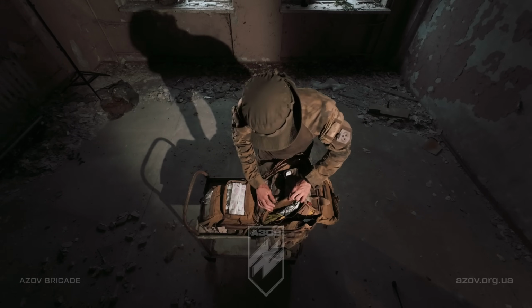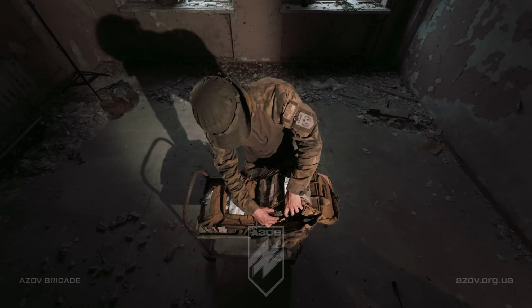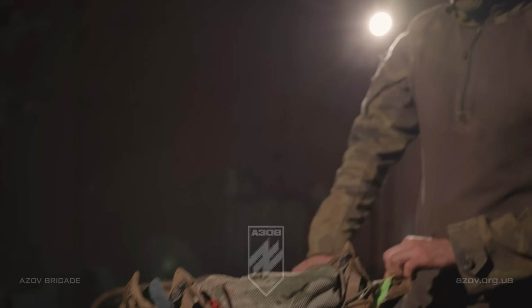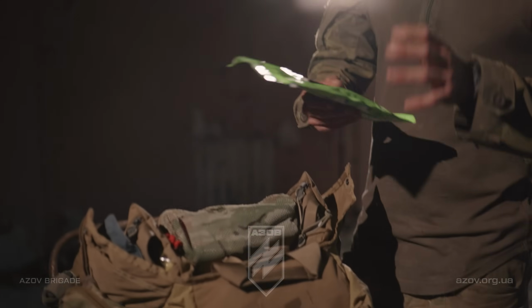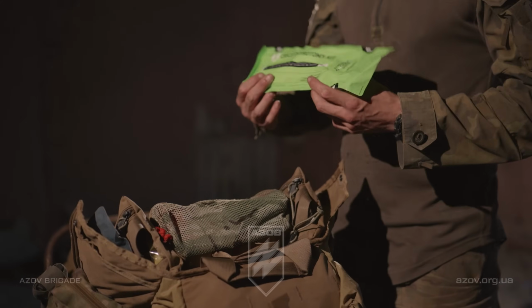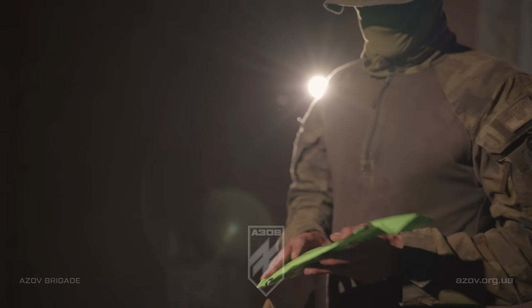I'm going to use them. I also have another 4 of them in here, all different shapes and sizes. Are you going to come to the other side? I have a splint, another splint tucked away. I also have a crike kit. Yeah, if I have to use this, then it's a bad day.